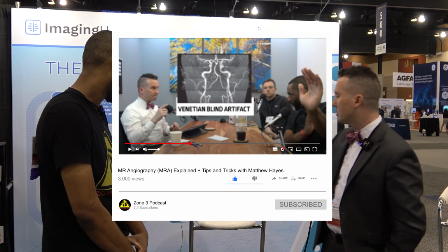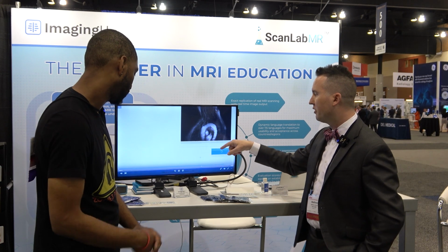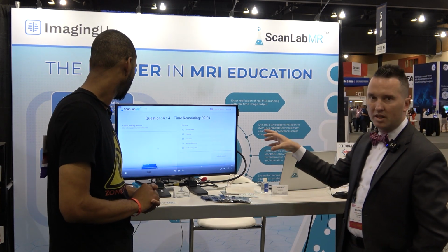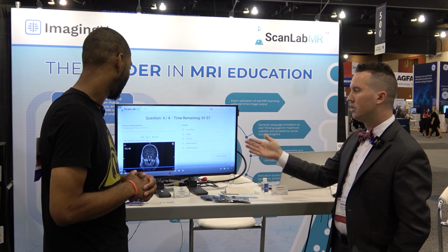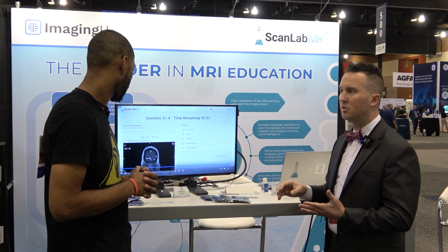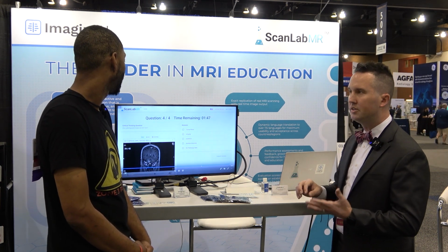But again, there's a little button down here that I'm telling it when to actually stop fluoro and actually start scan. Right. And just like we talked before, one of the big things that cause callbacks is not really recognizing pathology. And so, like I said, these are things we're trying to train people on and test them on, so that we reduce callbacks. We're able to really get a good idea.